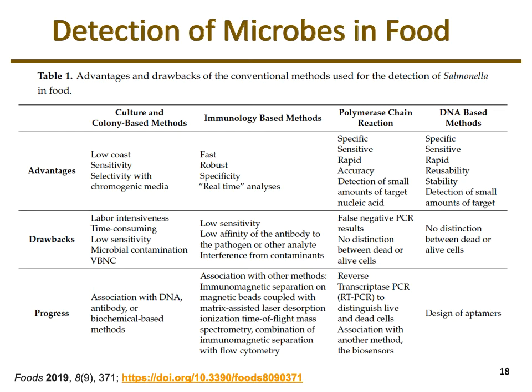So this table from this article that looks at different detection methods for Salmonella outlines some of the advantages, disadvantages, and what progress has been made for these different areas of detection. So I do highly recommend looking at this. It's some of what I've already mentioned.